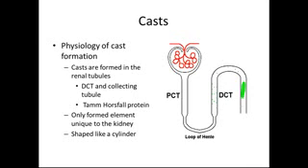Proteins aggregate into individual protein fibrils that attach to the renal tubule cells. Then the protein fibrils interweave, forming a loose network that then becomes a solid structure that lines the collecting tubule.